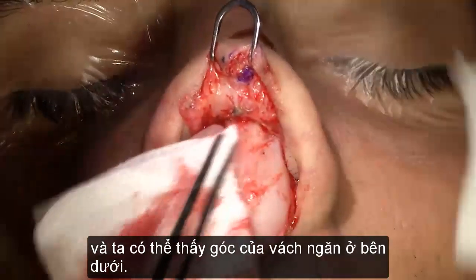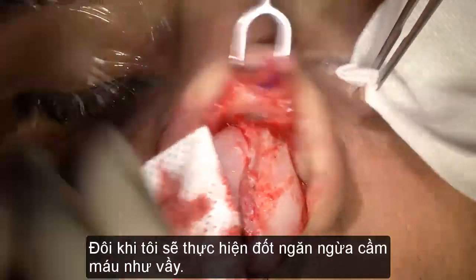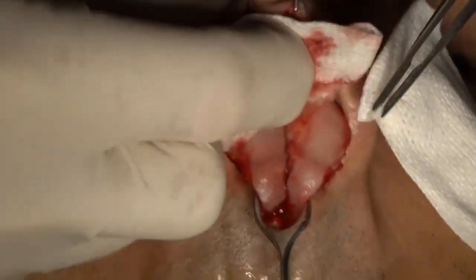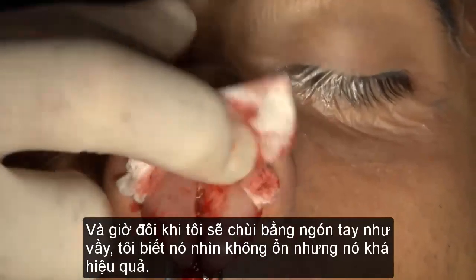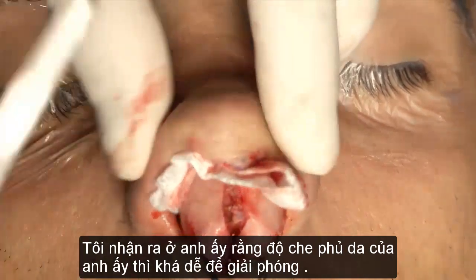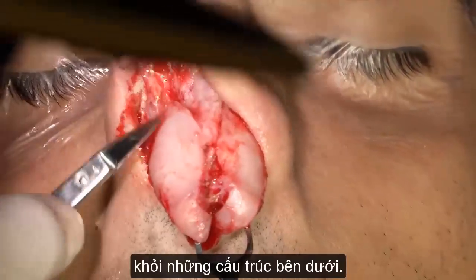All right, so we can see the septal angle down here. And sometimes I do this preventive hemostasis kind of thing, lower the bipolar. And now, sometimes I will even swipe my finger. I know it doesn't look very nice, but it's efficient. I have realized in him that his skin envelope is rather easily freed from the underlying structure.